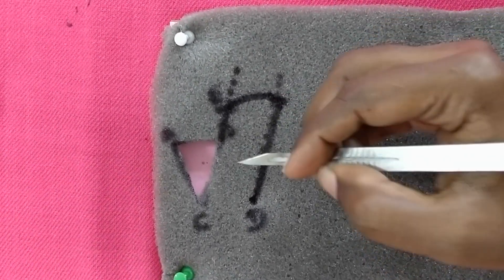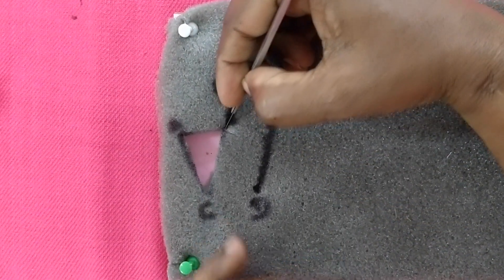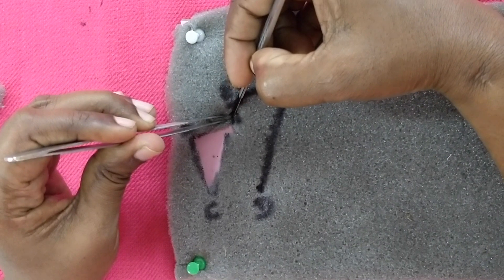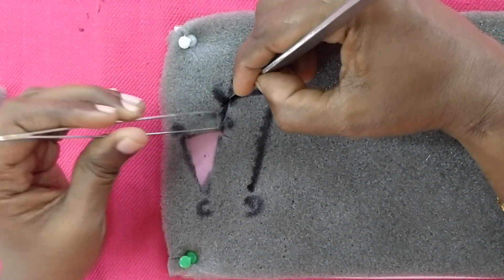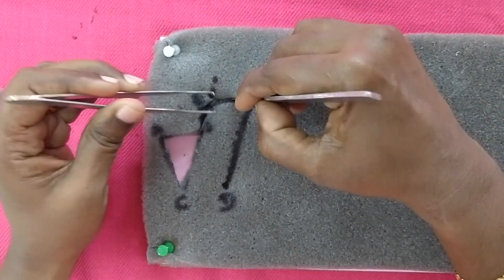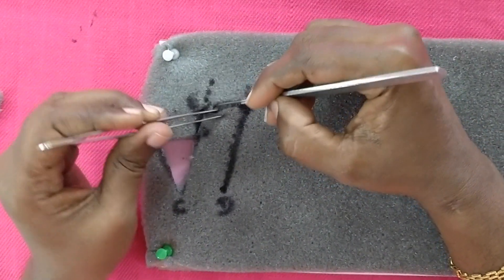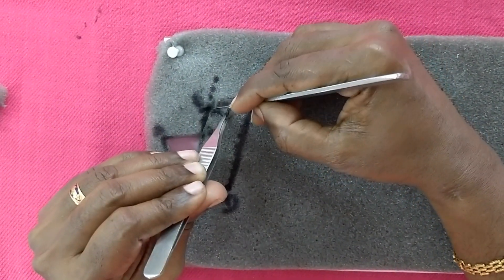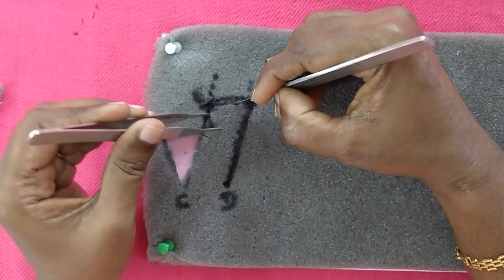Now the planned flap C, E, F, D is now raised. The incision is made first extending the defect, that is C, E. Then the leading edge of the flap, E, F, is incised.